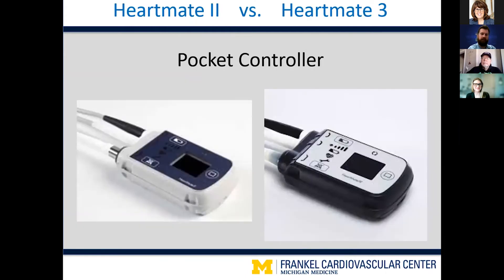The particular controller we have now for both HeartMate 2 and HeartMate 3 patients is called the pocket controller. If you notice, these two controllers are remarkably similar — in fact exactly the same. The only difference is the color scheme. The HeartMate 2 is on the left with a lighter tone and dark blue interface, while the HeartMate 3 on the right has a dark blue exterior with a white interface. The symbols and buttons are identical between the two controllers.